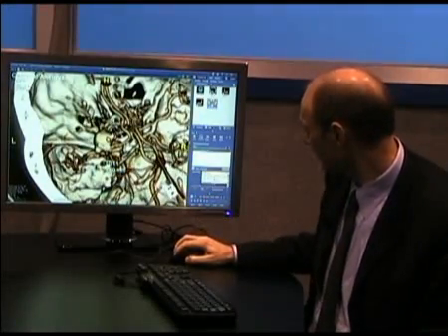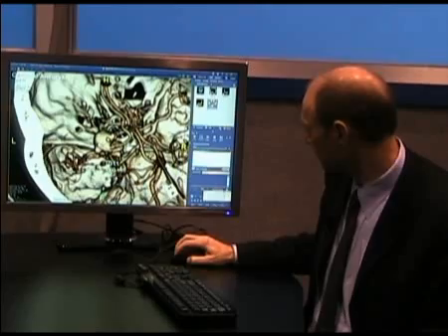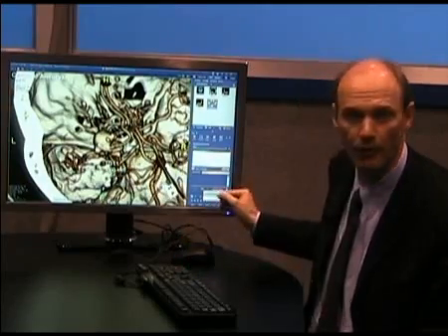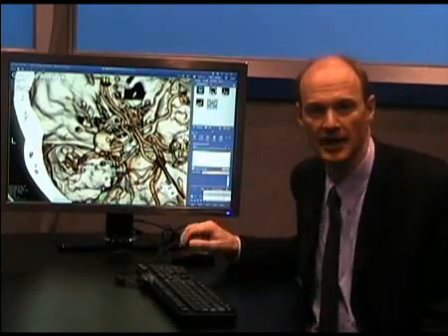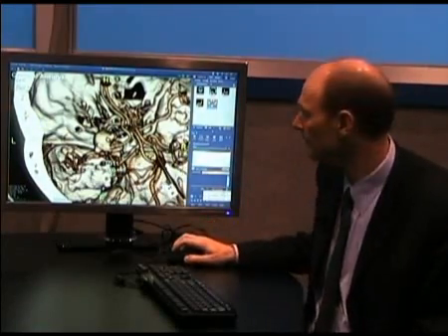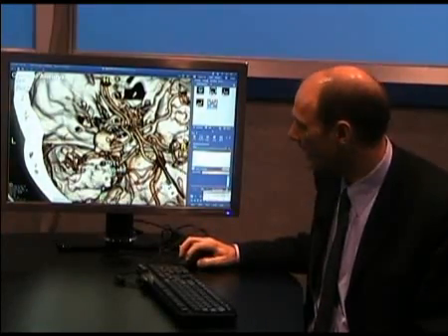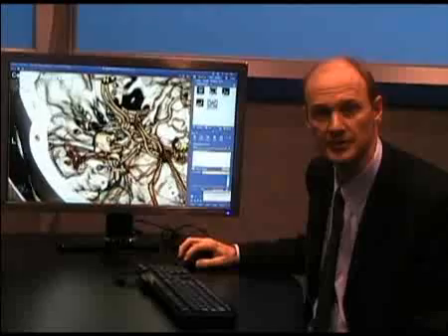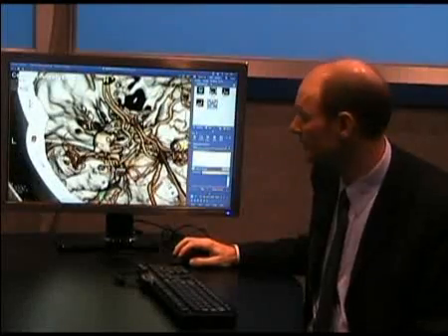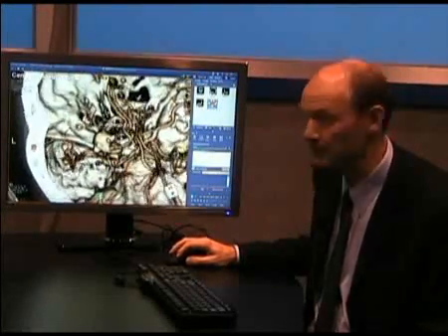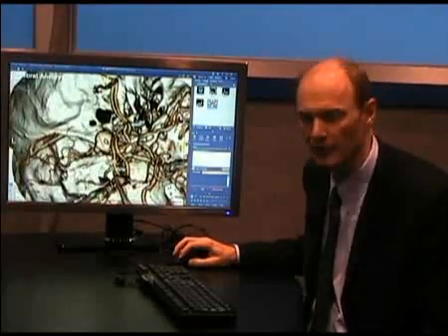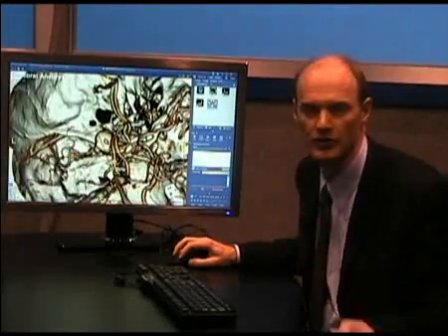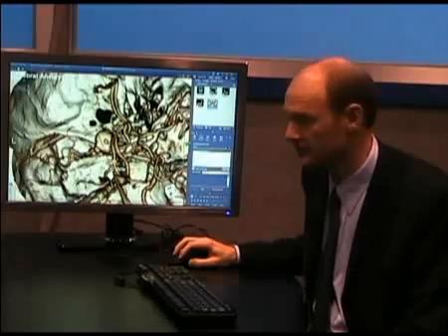From there, it's possible to then export the measurements using the AIM protocol. This allows us to get these findings and measurements directly into the dictation system or into a research database without any user interaction.